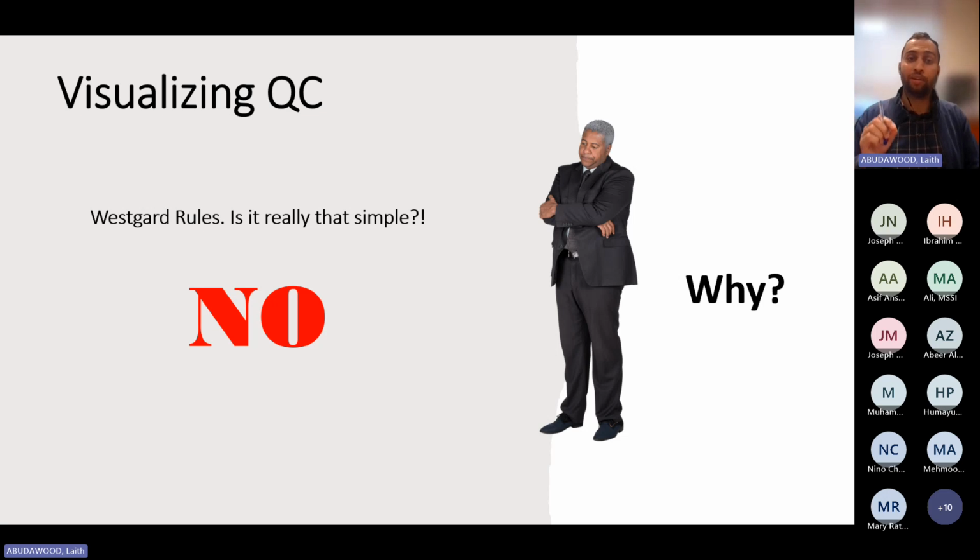This is a mistake that a lot of labs do. They apply Westgard rules to manufacturer ranges, and they end up having to do a lot of corrective actions unnecessarily. So this is one of the most common issues I used to see with customers in the field, using Westgard rules in the wrong way. And it will generate a lot of headache for you and for them. They will think something is wrong with their analyzer, where actually there is absolutely nothing wrong, just because they followed Westgard rules in the wrong way.